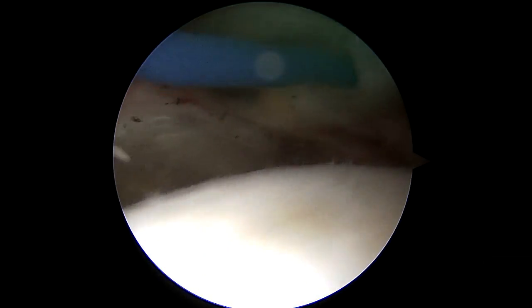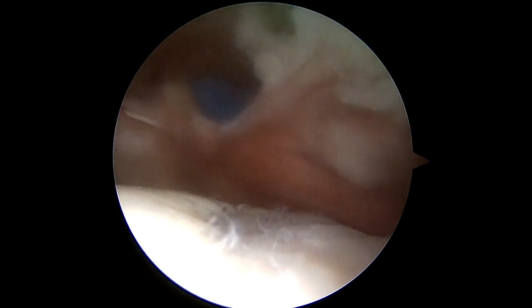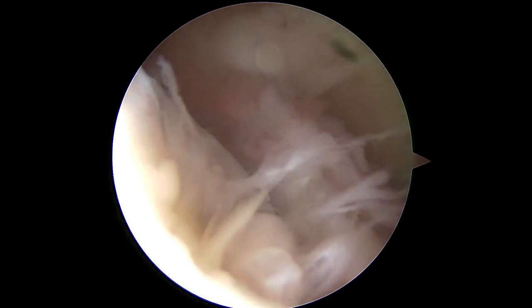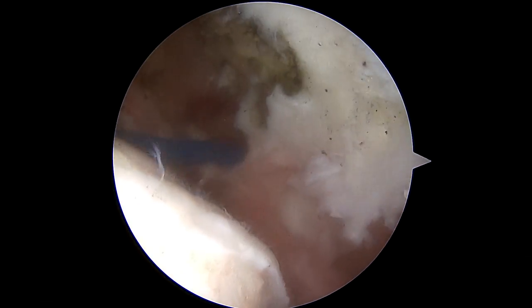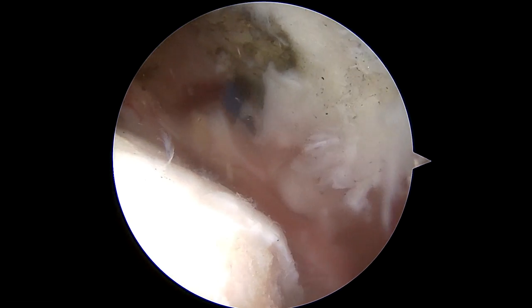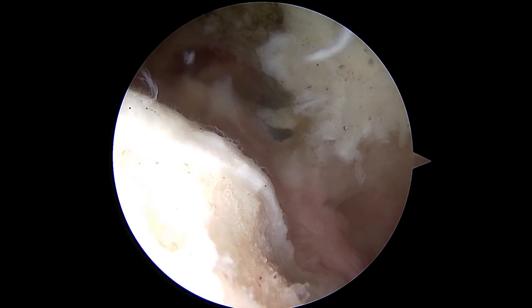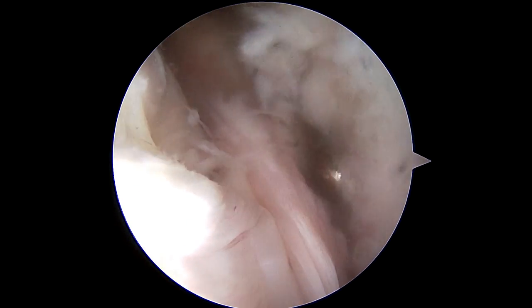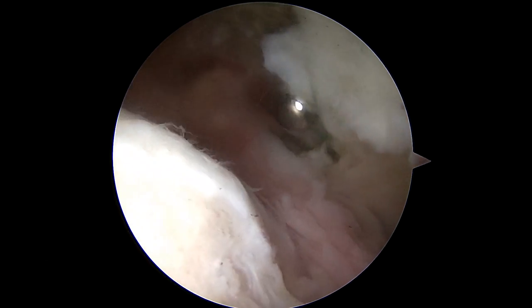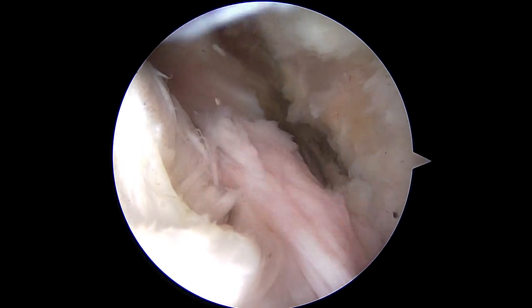On his plain x-rays he already has chronic proximal migration, but he doesn't have any significant glenohumeral arthritis — so that's the key here. Now internally rotating the arm, getting back a little more posterior, I want to see where the intact rotator cuff is. This part of cuff here is a bursal leader — it goes from the subacromial space over to the internal deltoid fascia. This is not rotator cuff, so we might as well just split through that. This is the type of cuff excavation you've got to do to see what cuff is left and what you need to substitute for with your superior capsular reconstruction.